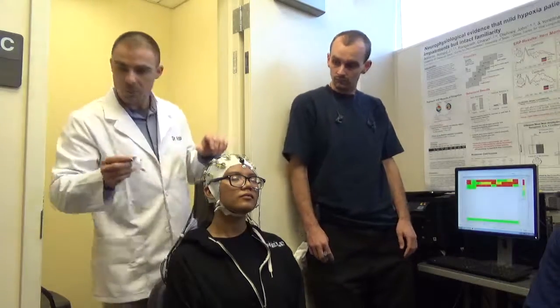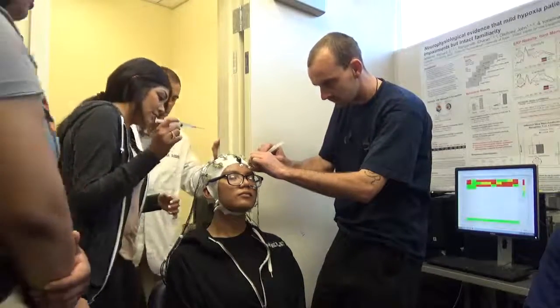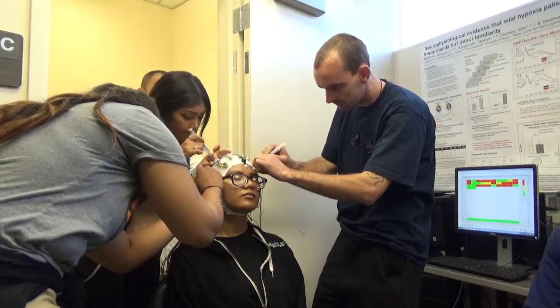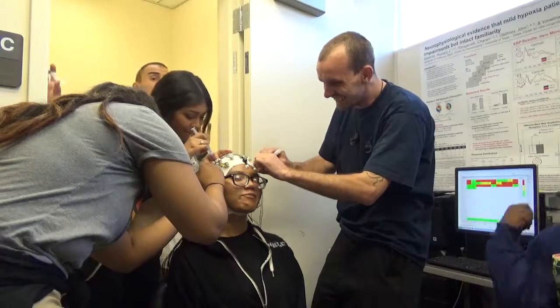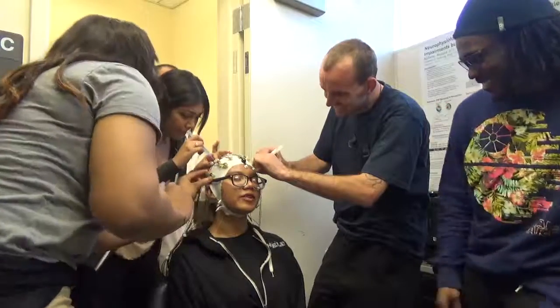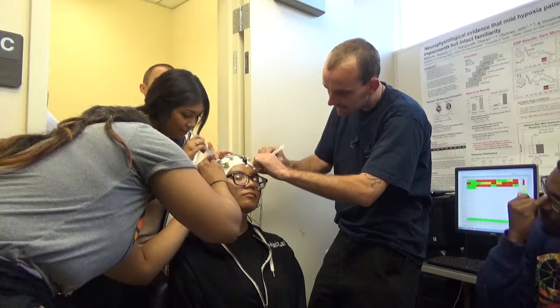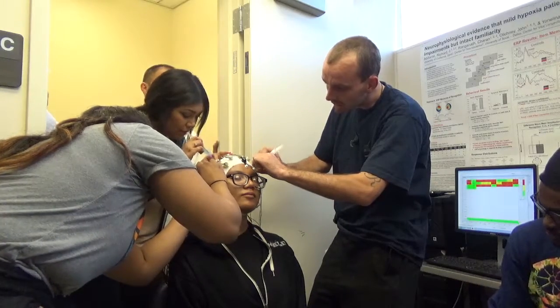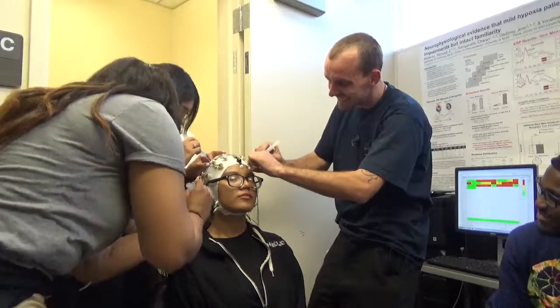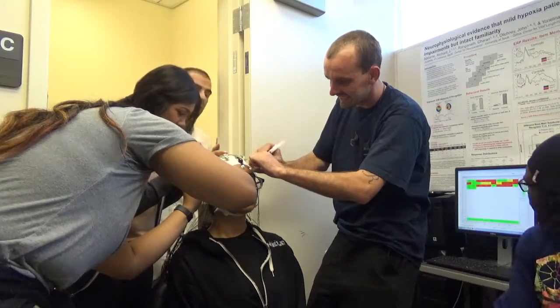Okay, so why don't you guys come in and do some of these red ones? Talk with her. Let me know when I hurt you. No, you don't say that. Remember, this is a professional scientific research environment. If you feel any pain, let me know, please. I'll stop. So you first want to ask, can you feel it at all? Because you want to make sure that you are actually making contact with the scalp. Can you feel that? Once you know that they can feel it, now that's already green.